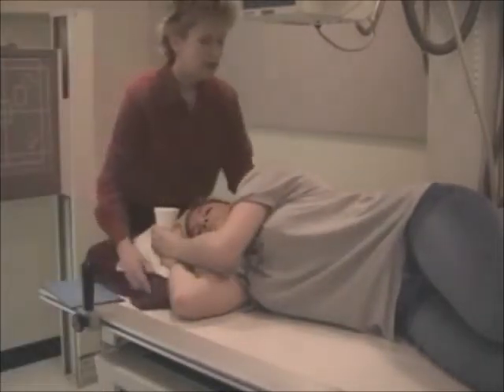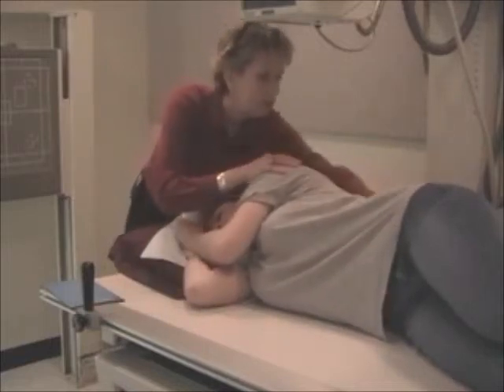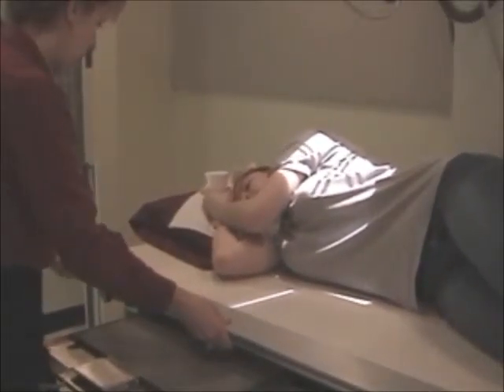Make sure they're straight on the table and in a lateral position, checking their hips and their shoulders. And the film's edge will remain at the level of the mouth. You would change cassettes, and with a right lateral, I'd use a right marker, again moved in a ways. And the film's edge will be level with the patient's mouth, and then think back what I said a few minutes ago.